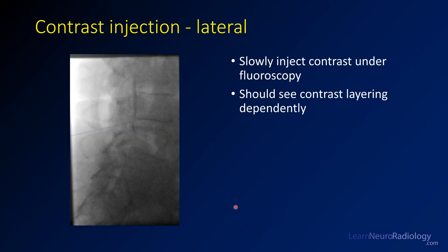If you need to troubleshoot, you can move to the lateral position. Here's what an injection under lateral fluoroscopy should look like — you'll have contrast pooling in the dependent portion of the patient. This patient is prone. If the patient's on their side, you'll see it filling the entire thecal sac, and you can slowly inject with fluoroscopic guidance under lateral if necessary.